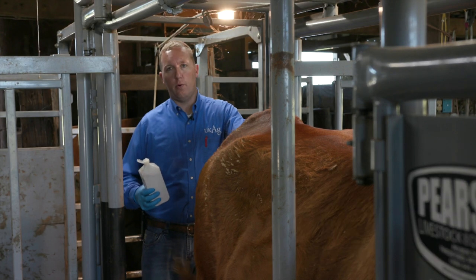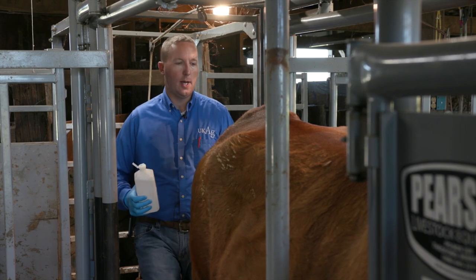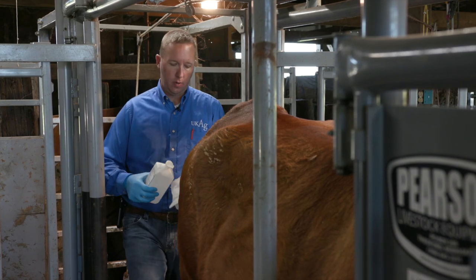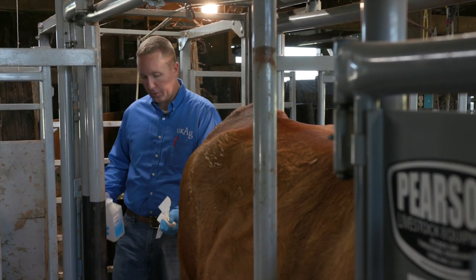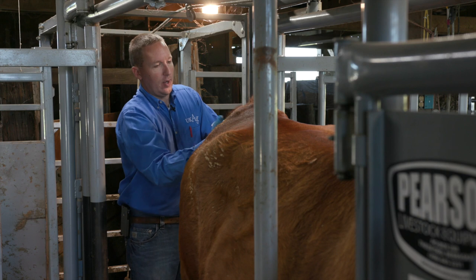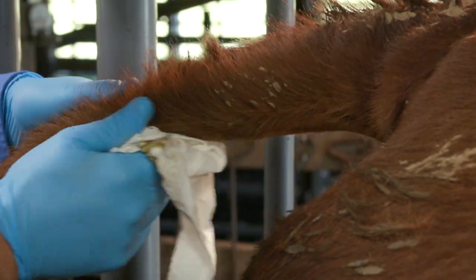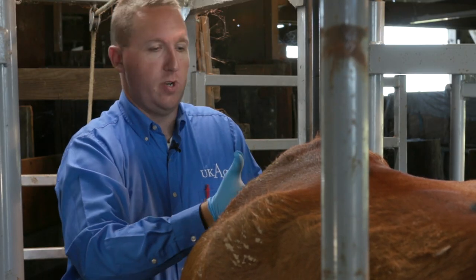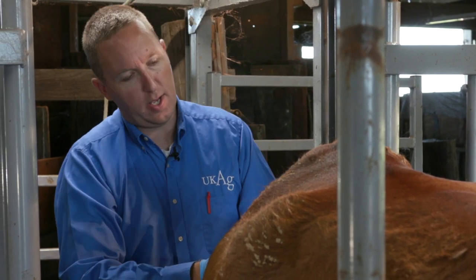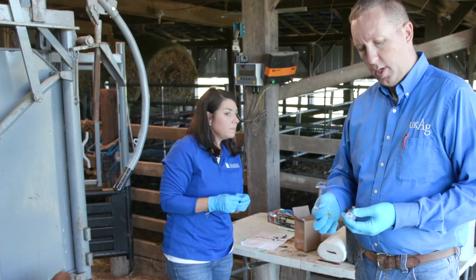We're at the rear of the cow where we'll take blood. I have cheap isopropyl alcohol and a paper towel — the cow is fairly clean but we still want a good clean sample. I'll put a dab of alcohol on the towel and clean the bottom of the tail, feeling for the spinal processes as I go. We want to clean roughly a foot of tail from the inside of the tail head down, then let it dry as we get our needle ready.